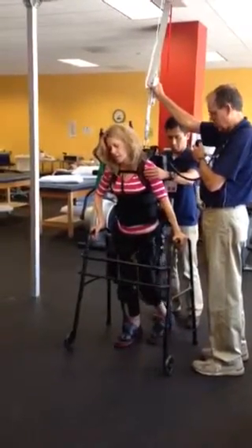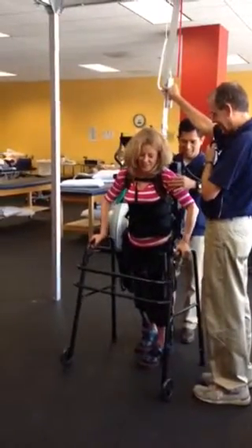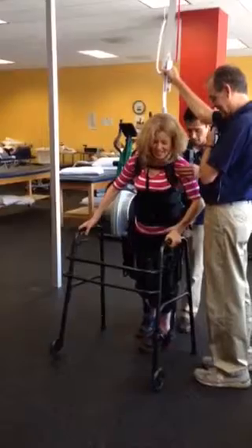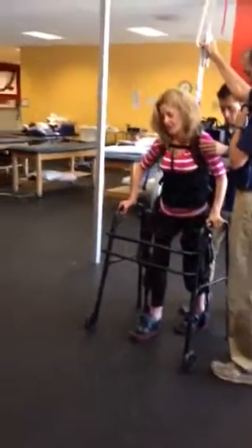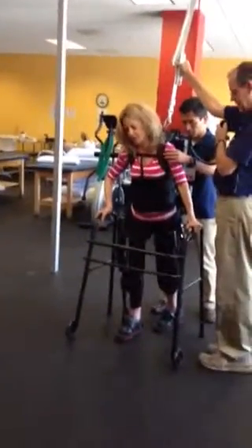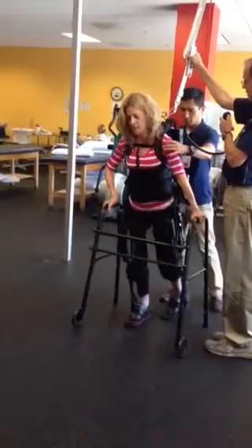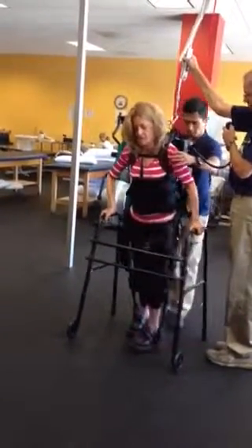Good. I think I'm going to fall. You're still not going to fall. You got the forward — let's work on the side. One step. Good. Walker. Forward. Good. Now lean right and forward. Go over that right leg. Right there. That's where you want to be. Hold it. Hold it there. Step. Good. Walker.